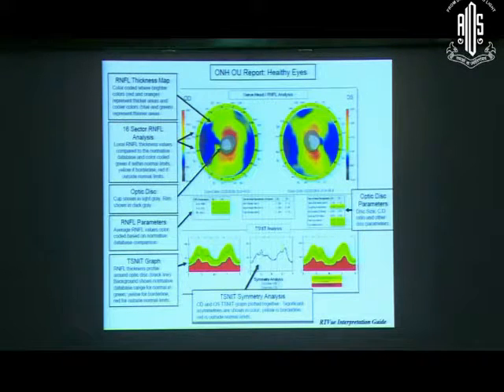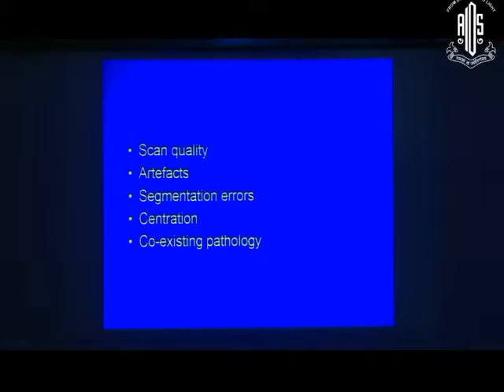If you look at the RTVue OCT, very similar, same color pattern, except that your abnormalities are marked in the ring out there. The average parameters look like this, and the thickness map looks like that. But before you start interpreting a scan like this, you need to look at some of the things.